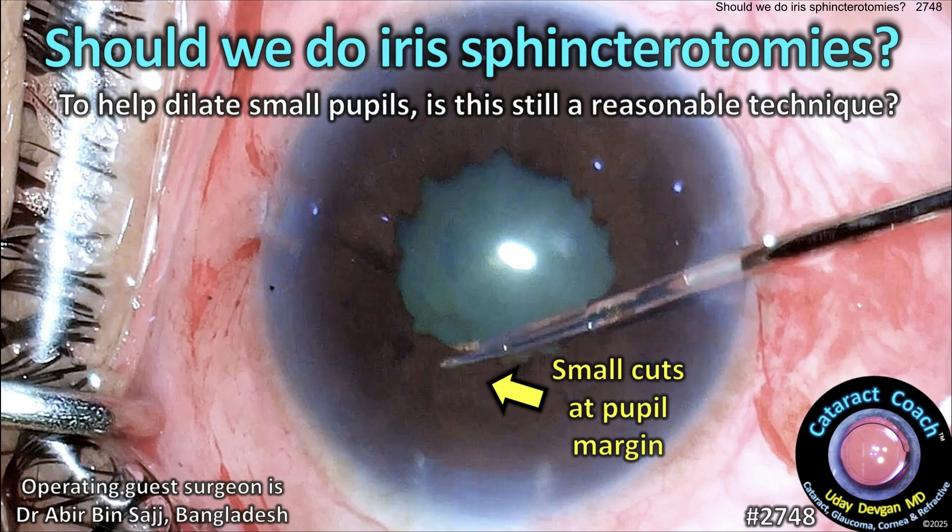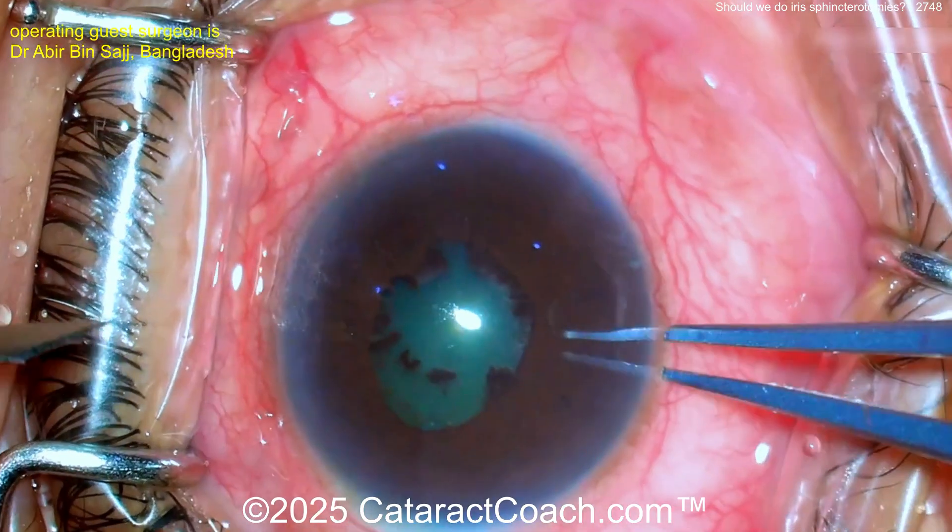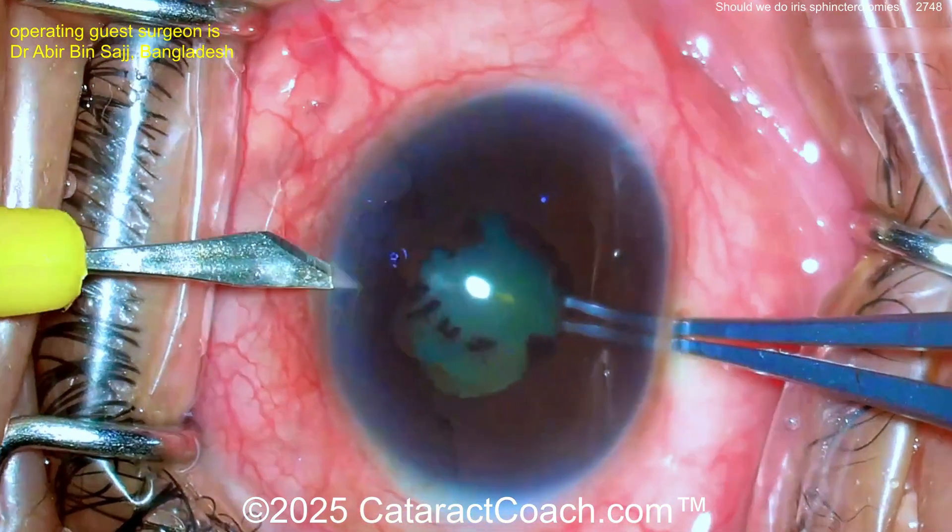From cataractcoach.com: should we still do iris sphincterotomies to help dilate small pupils? Is this still a reasonable technique? Here you can see this patient has a small pupil, with some synechiae that were already present and partially broken with the dilation drops.